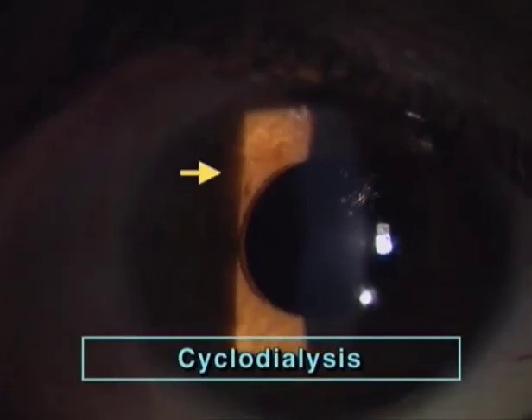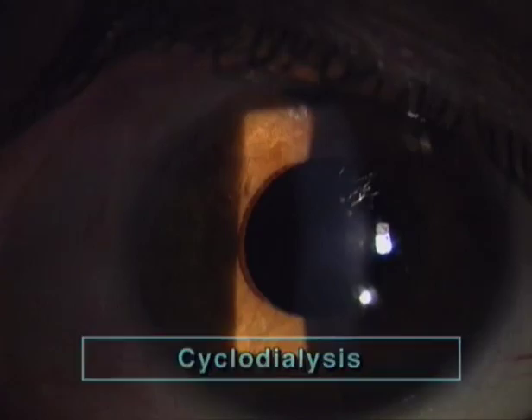Easier to recognize is the damage here caused by a cyclodialysis spatula. The detached Descemet's membrane has formed a flap, which has a glass-like appearance in retroillumination and light-conducting properties. In contrast, the margins of the still attached flat Descemet's membrane are very difficult to bring into focus, but can be recognized in retroillumination.